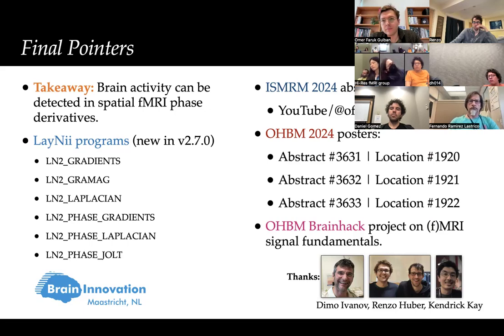Here it makes sense, and again I like the phase jolt, because you're taking second derivatives, both for the Laplacian and the phase jolt. But in the phase jolt, you're taking the L1 norm, so that accentuates whichever direction has the highest derivative. It's a nonlinear combination that accentuates. So it's pretty cool, and that does make sense why you're seeing these bigger effects. But the interpretability is, if you're trying to measure connectivity, which is what they're trying to do, maybe the Laplacian is. Yeah.